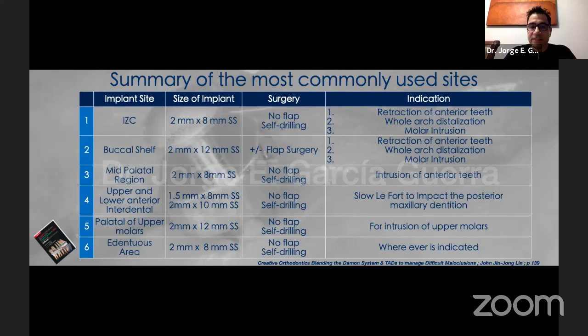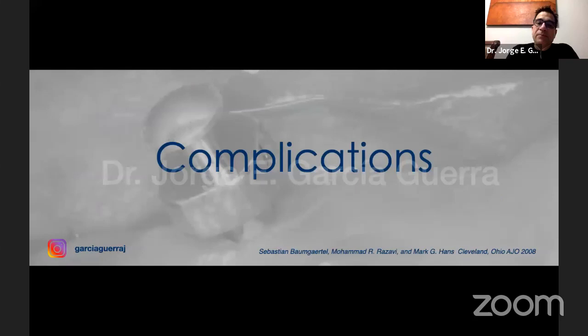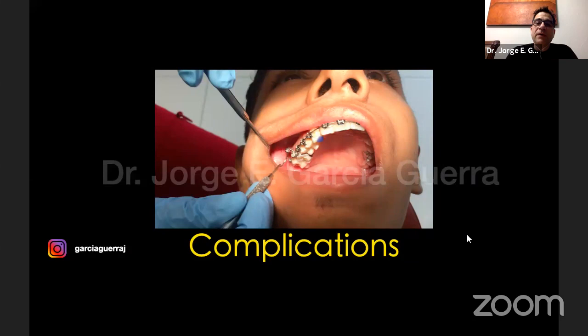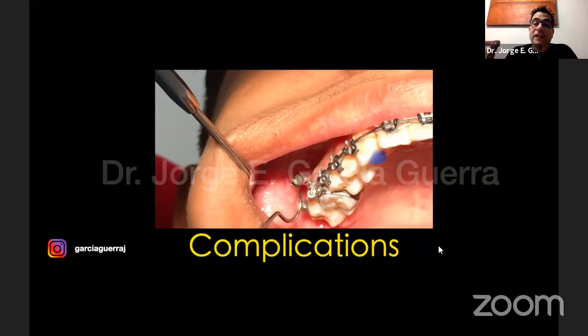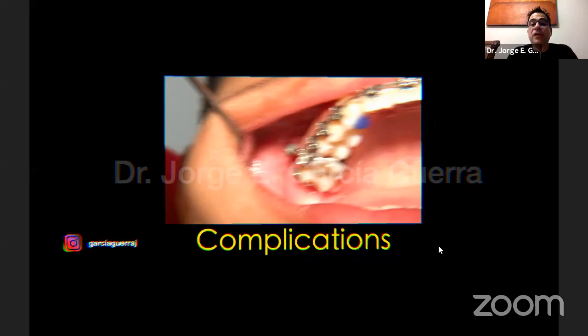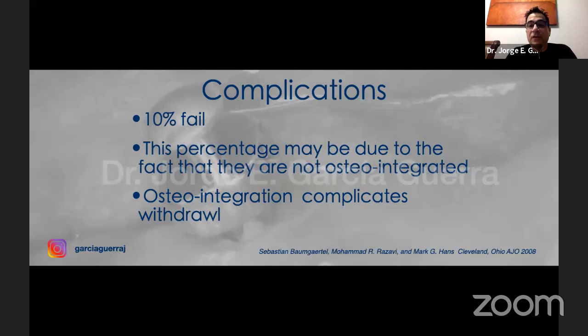Okay, now when we put mini implants, we can have complications. I'm going to show you here. This is a video of a student of mine who one day came to me and told me that she had just put an implant at the prior appointment, and you can see the movement it had. Obviously, we have a failure here. It's very important for all the students to understand that you're going to have failures in your treatments. About 10% of the implants that we put in a patient's mouth are going to fail.